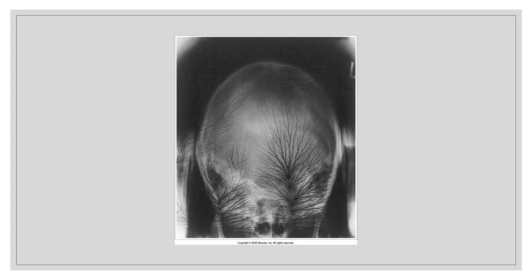What type of artifact? This is something that's not really seen today. This artifact is equipment. It's a static artifact. Usually happens in winter when it's dry. Why does it show up black and not white? Because the light spark usually occurs when you pull the film out of the bin quickly, and you would hear a snap and see a spark, and this would create the static, and this is the effect that it would show.